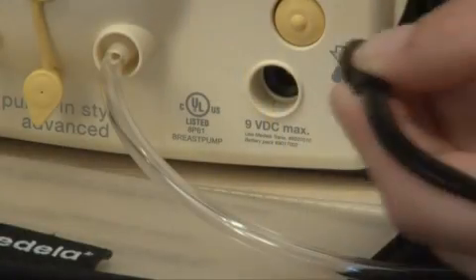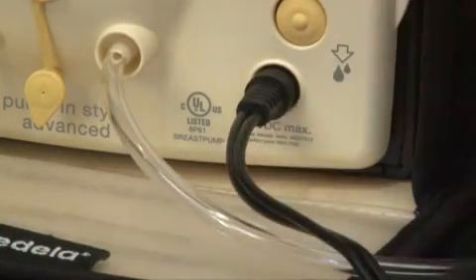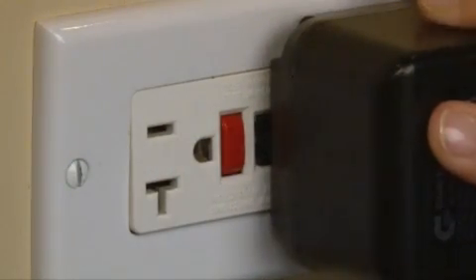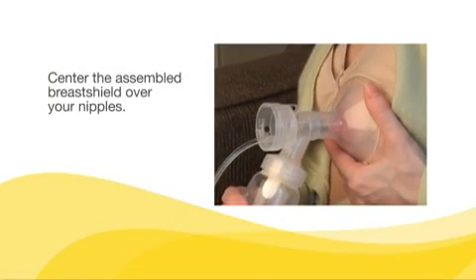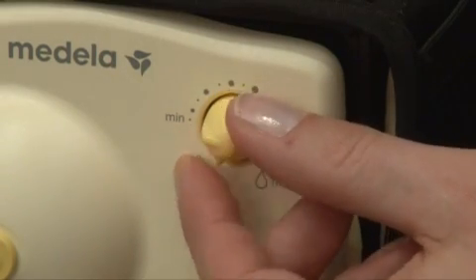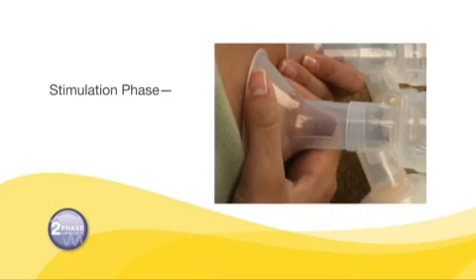Plug the metal fitting on the end of the Medela power source into the power jack on the breast pump. Plug the adapter into a standard electrical outlet if you are using the AC power adapter. Center the assembled breast shields over your nipples. To begin pumping, turn the dial clockwise from the off position. Pump in Style Advanced will start in the stimulation phase.